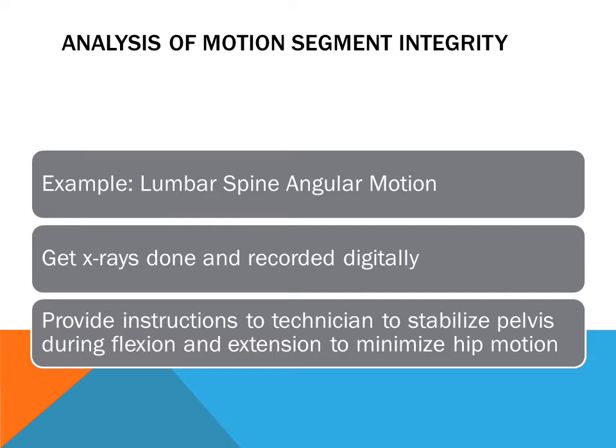And remember that the whole philosophy of this program is to increase the persuasion power of your reports. And nothing is less persuasive than low quality, non-diagnostic x-ray images. You are responsible and you want to make sure that the images that you get are of tip-top quality, perfect diagnostic quality.